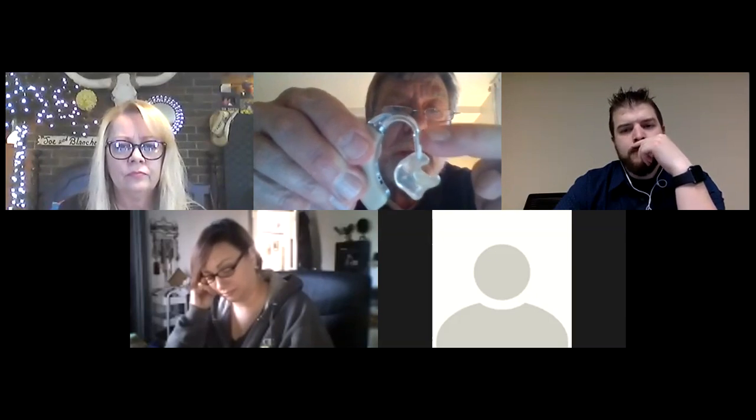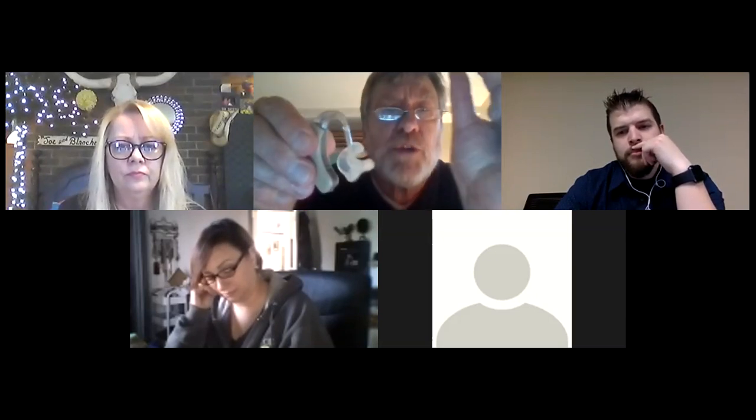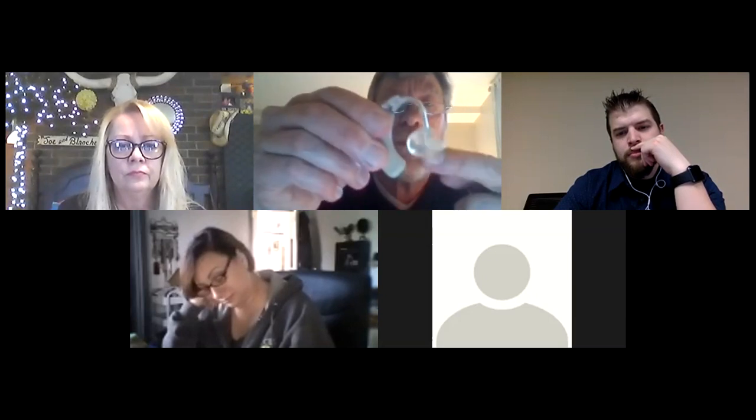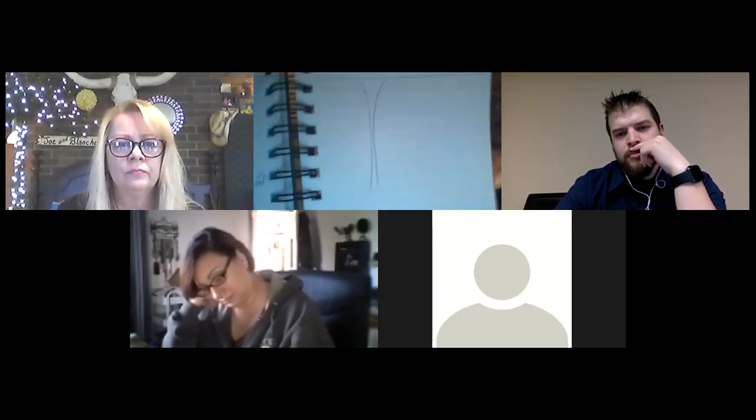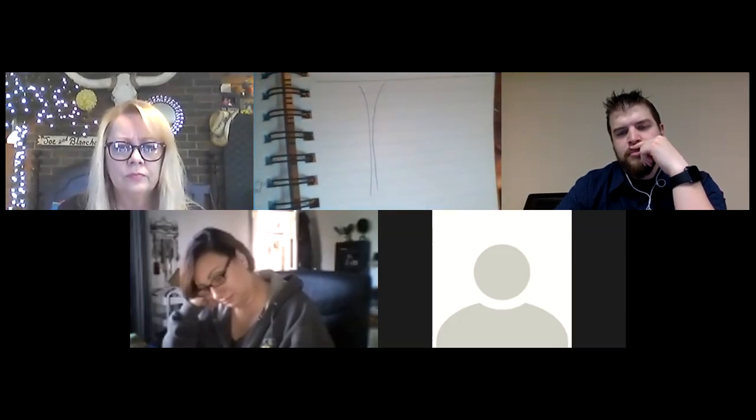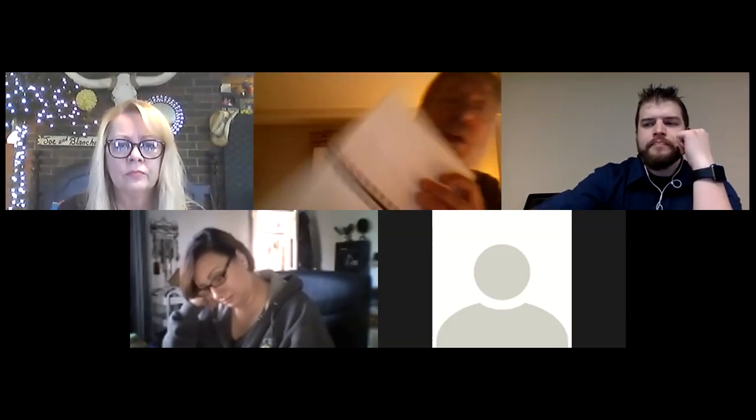If you see somebody with a high power BTE and the tubing is cracked or very dry, when it dries, the plastic becomes brittle. It's no longer soft, and it actually ends up looking pinched. And if that's the case, you are going to lose a lot of high frequencies.